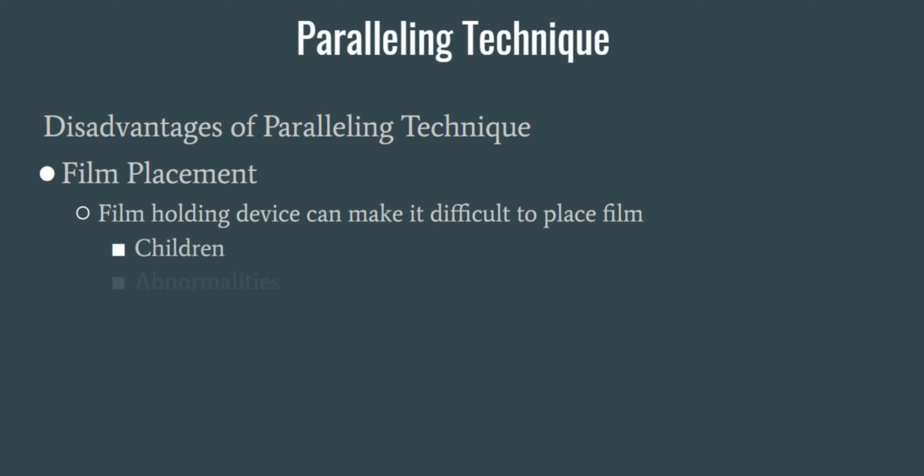especially with children and those abnormalities that we've sort of discussed. It's going to be more difficult to get that XCP in a child's mouth than it is to do it in an adult's mouth. That's just one of the challenges that you will have to face. And then the discomfort. It's going to maybe pinch on some of those oral tissues and cause discomfort for the patient. But as I said, we can kind of get around that. We have different techniques that can be used. And with that little sticky styrofoam stuff that acts like a cushion, it's made it easy breezy.